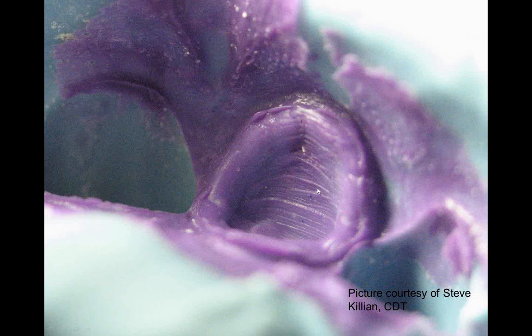All right, now this one is actually one of my favorites. This thing looks pretty good, actually. If you take a look, there are some areas I want you to be concerned about. Now, Darren, around here, we're always focused here, but this isn't all the story of where the prep is. It's also your abutment. What's going on? If you take a look at this, it doesn't look like everything got mushed in the way it should. It's granular looking. Maybe something's wrong there. Let's see what happens if we go ahead and just pour this up.